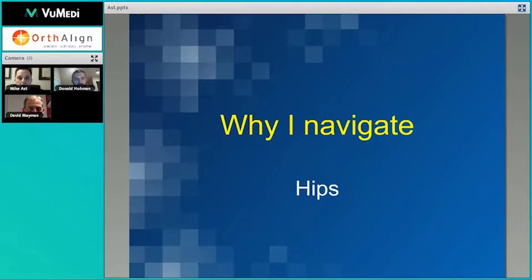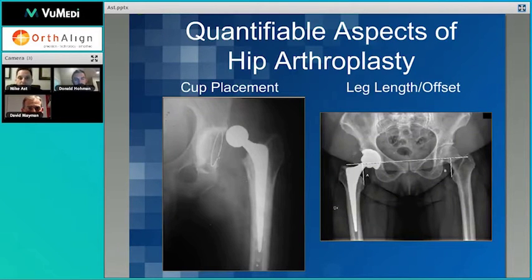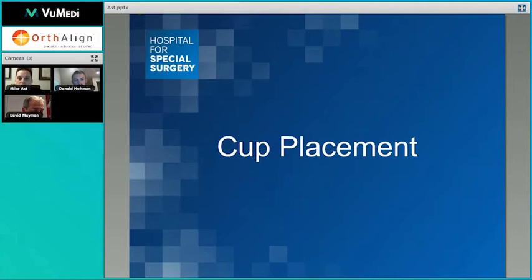So the first question, of course, is why would you even bother coming to this webinar? Why do I navigate hips? Well, I navigate hips because there's only certain quantifiable aspects of hip arthroplasty. The most commonly discussed are cup placement and leg length and offset.